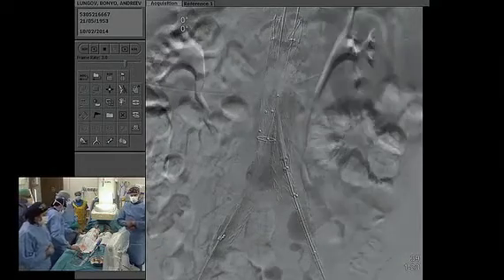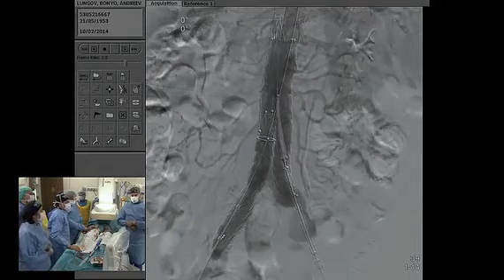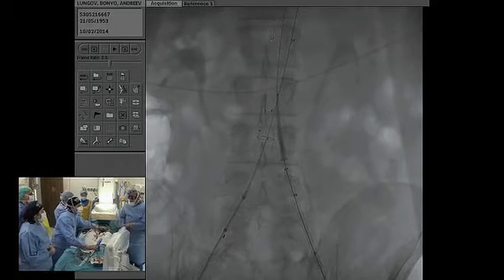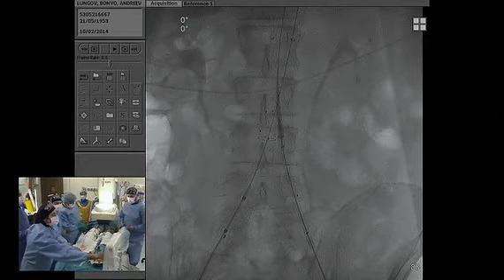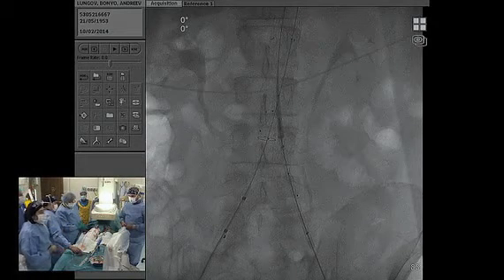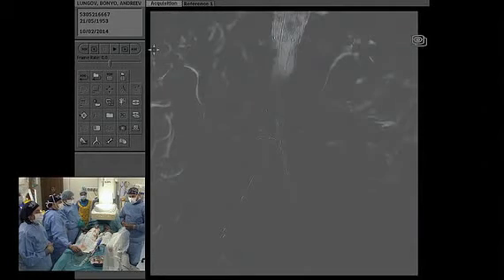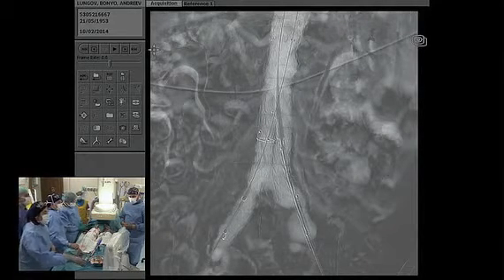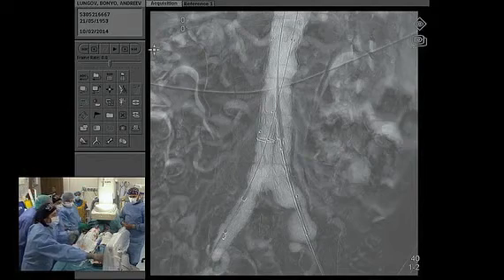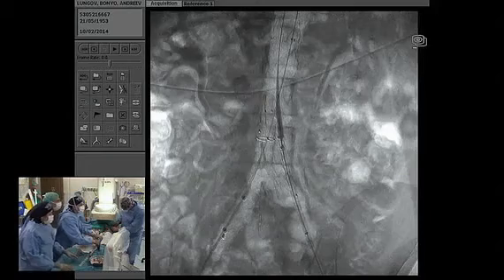It does appear from this image, Ivo, that you can seal above where the distal aneurysmal segment is to exclude the abdominal component. Okay. Roadmap. I will do a final roadmap now, and we will proceed with the final openings of the left. Okay, I'm proceeding.